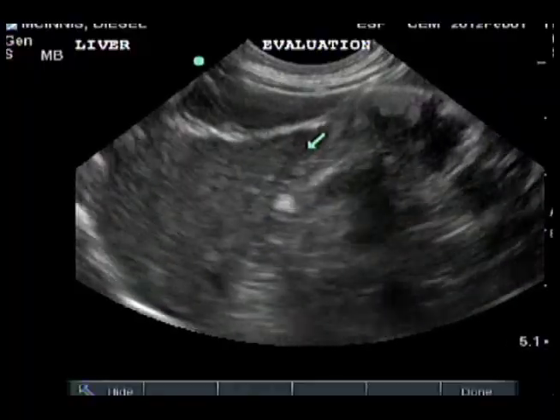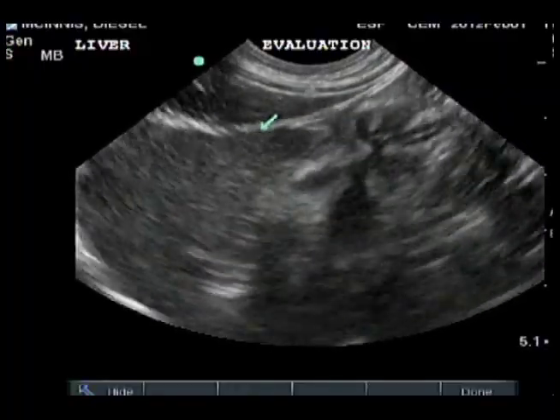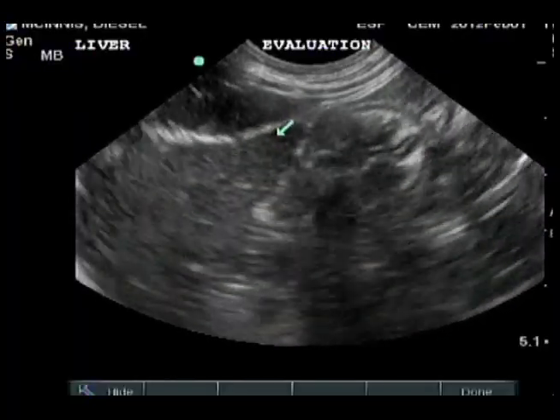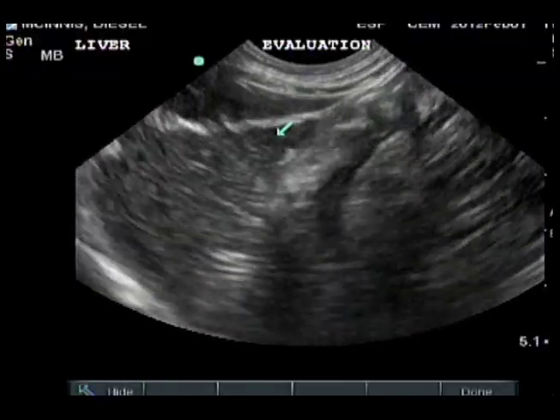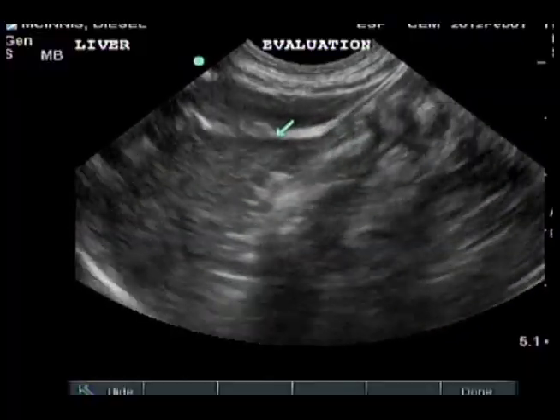Look for lesions of hyperechoic or hypoechoic nodules, increased size, decreased size, mineralizations, dilated bile ducts, rounded liver lobes, or cysts. Examples of these lesions are shown in the liver DVD.